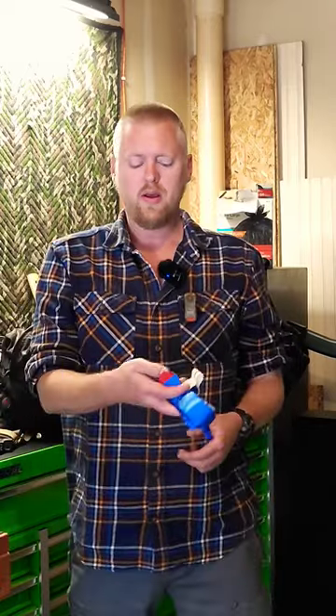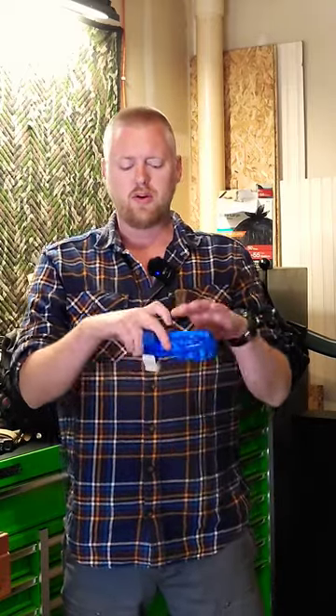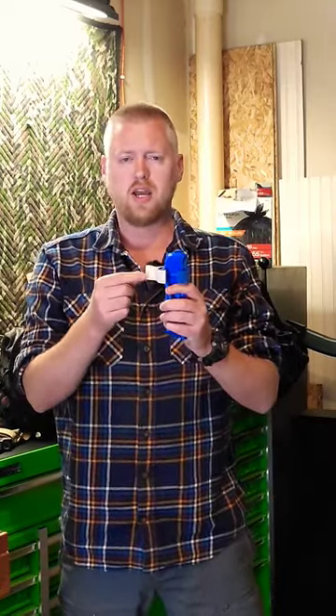Quick and dirty basic tourniquet. All you need to know starts with how you stow it. You gotta stow it in a way that when you grab it, you can locate that red tab with your thumb. Make sure you bunny ear out this little time tab.